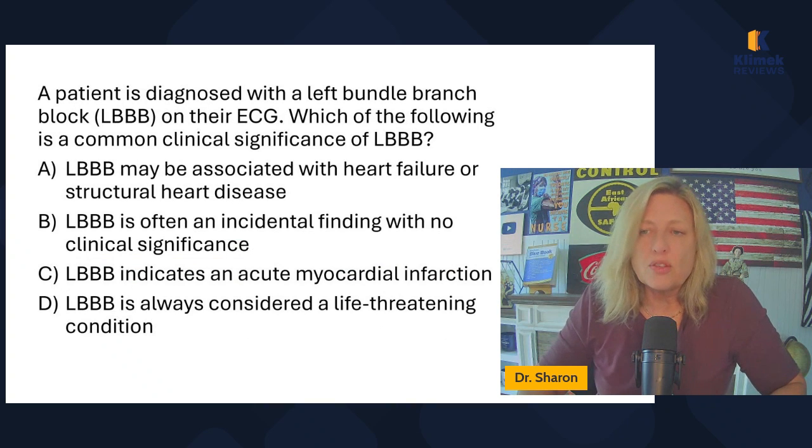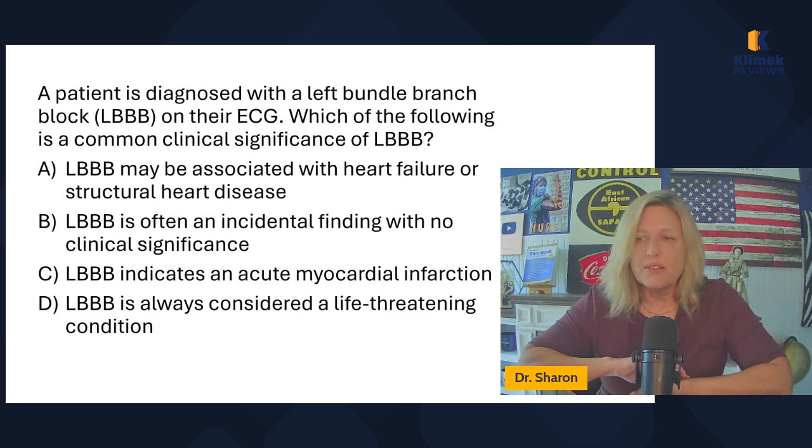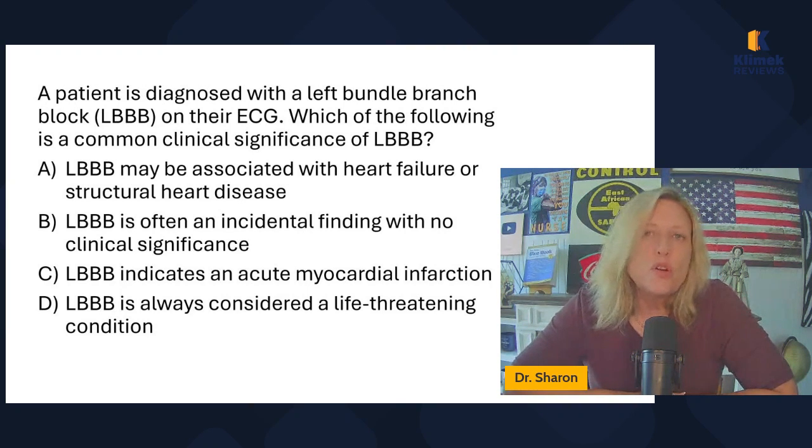A patient is diagnosed with a left bundle branch block on their ECG. Which of the following is a common clinical significance of left bundle branch block? So I will say we don't generally treat bundle branch blocks. If you see a bundle branch block, I mean, you have to go with whatever your doctors want, whatever the hospital policy is. I'm just telling you from my own personal experience. Generally, I don't call the doctor about bundle branch blocks.